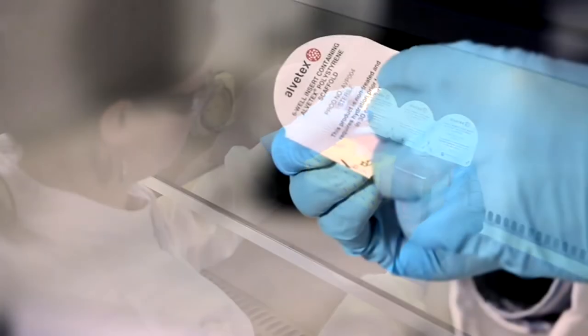All of our products are supplied sterile, individually blister packed, and ready for immediate use.